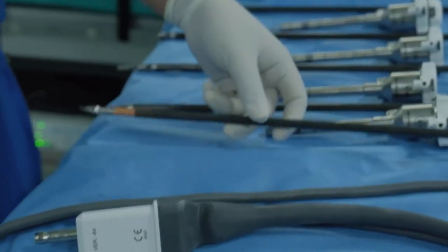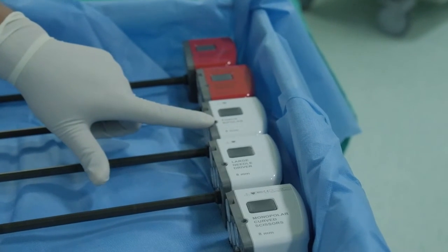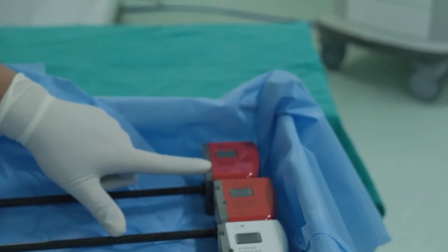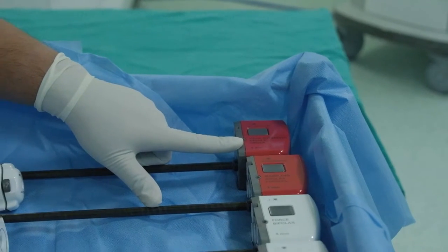These are the robotic instruments. You can see the white colored instruments are for use in humans. The red instruments are training instruments. They are not for use in human beings, but they are for training in dry or wet lab.